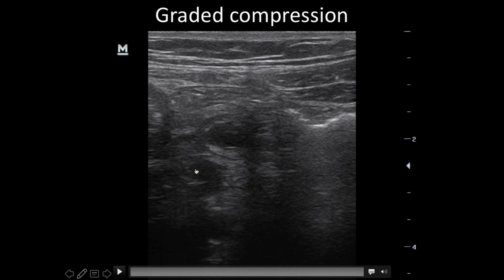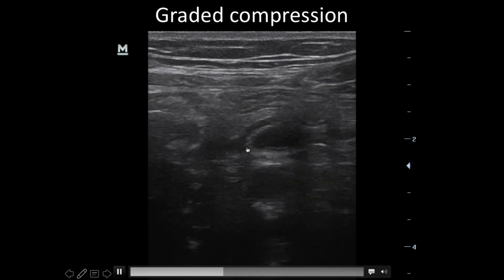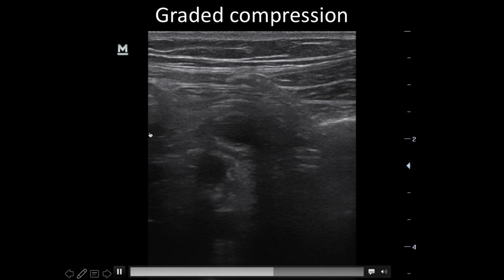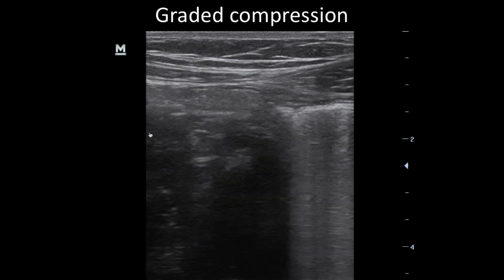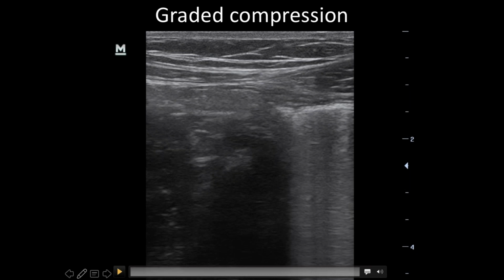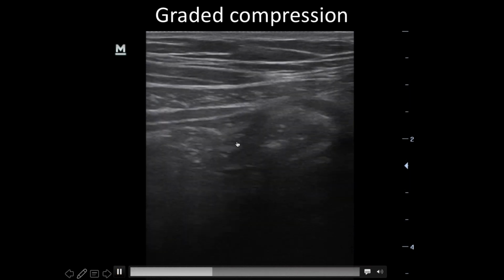And so this is the iliac vessel underneath. And I want you to focus on this area right here. That's what we are starting to look at now. And that looks like it's the appendix. That's looking like appendix. It connects to something here. And I'm going to trace that. And it's going to be the cecum. So in the next clip, we show that this appendix is going right up to the cecum.